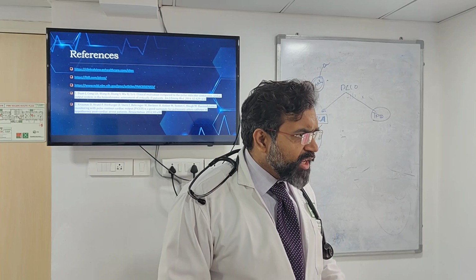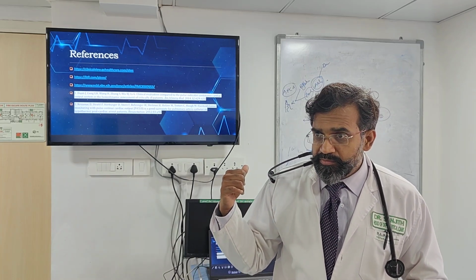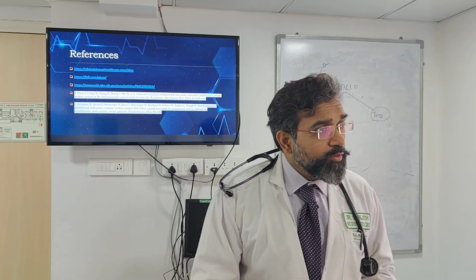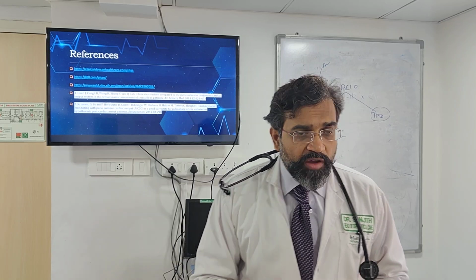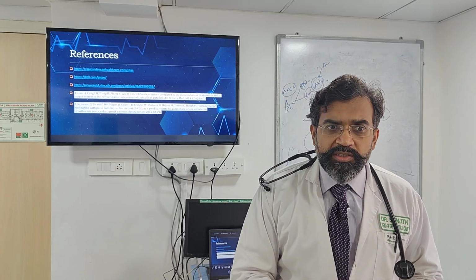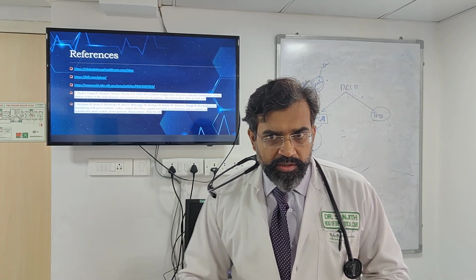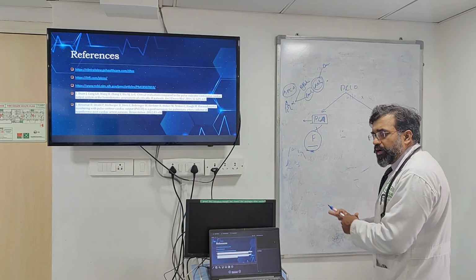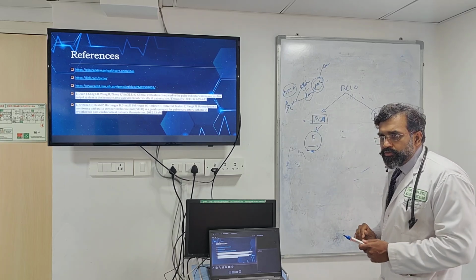Okay. Clear on this? It's making that more calibrated. What did I say? It's not measuring. It's just telling you this is the amount. You multiply this and this is what you're getting. Now I want to get it to be more accurate. So now I'm going to say, when it is most accurate, this is the cardiac output. And how do I know when it is most accurate? When I do a thermodilution. Then it looks at what I'm getting here, and whatever you're getting after thermodilution, it adjusts that and says this is your cardiac output.